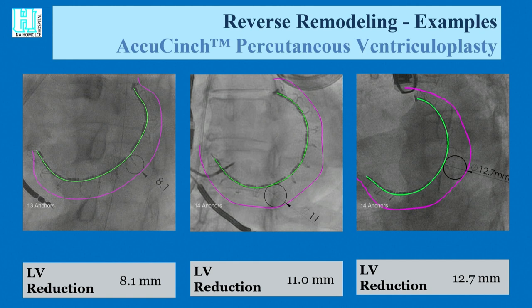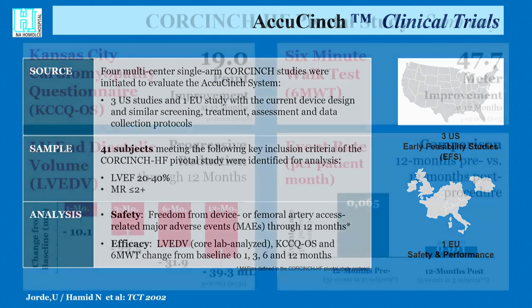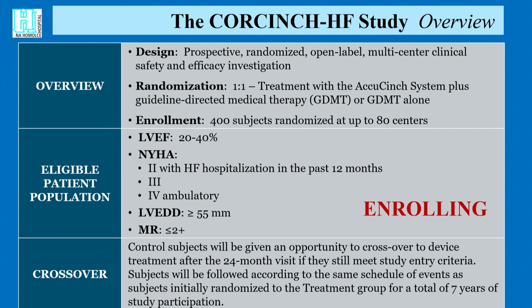There are several examples of what you can do very effectively, and the worldwide clinical trials are running. I wouldn't like to go into much more detail, but we know that we can be even comparable with the BioVentrix trial of the BioVentrix system, we can really very effectively lessen the diastolic and end-systolic volume index. So again, better than cardiac surgeons, or maybe better than cardiac surgeons during the time of the STICH trial. And so hopefully this study, the ID trial, which is just starting, could answer if with this remodeling we are able to lessen the inducibility of VTs. And this is a question.